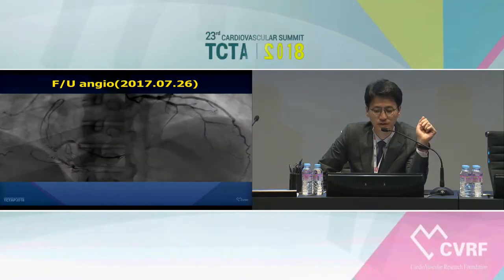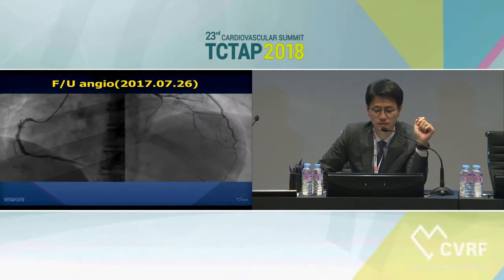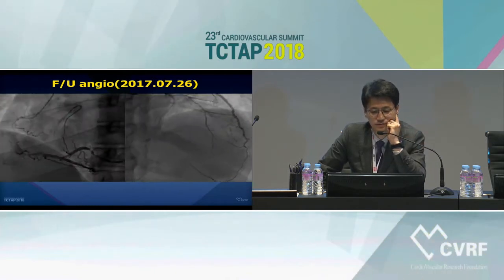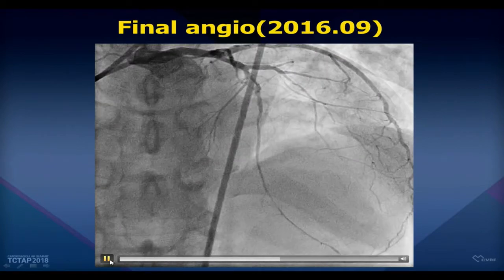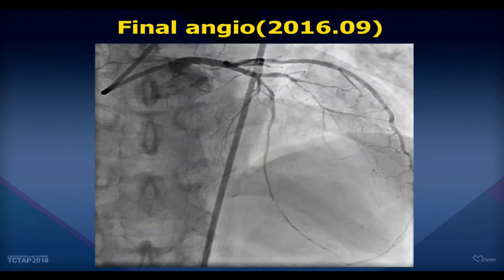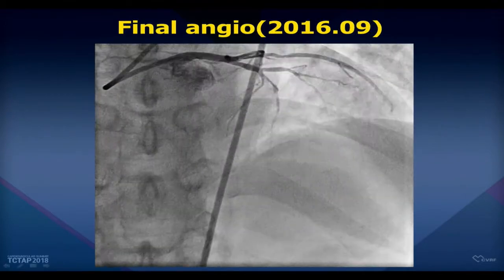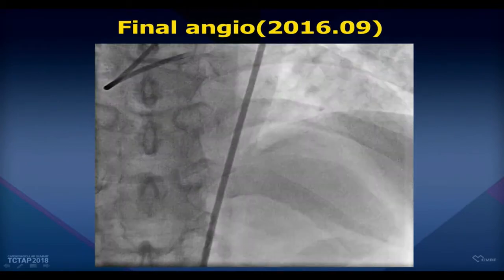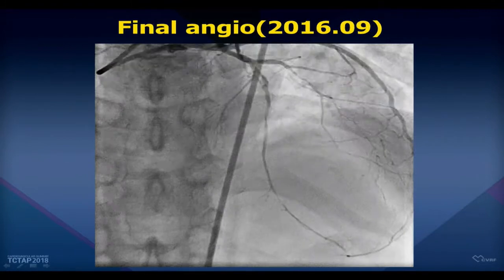Are there other opinions? Could you show us the first attempt angiography? Okay, back to the slide. This is the final shot of the failed antegrade LAD CTO PCI. There is almost no branch, and the proximal part is dissected. According to this, the guidewire advanced until far distal of the CTO region. Okay, one back, please.